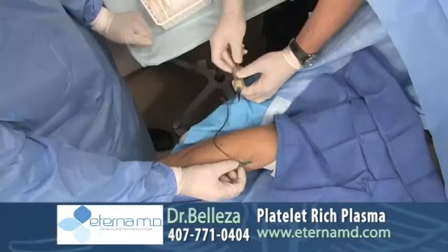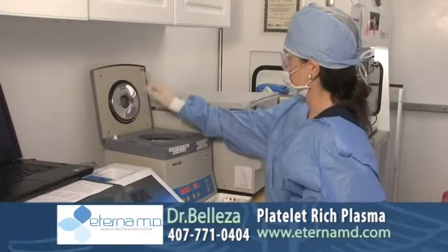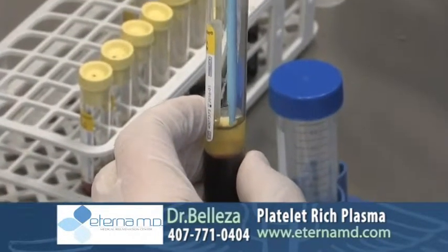The step you see here is where we're drawing the blood. From this point we'll take the blood to our in-house laboratory, which is dedicated to making different types of blood products. In this case we'll be doing PRP treatment, and we'll process the blood in the lab to get the PRP.